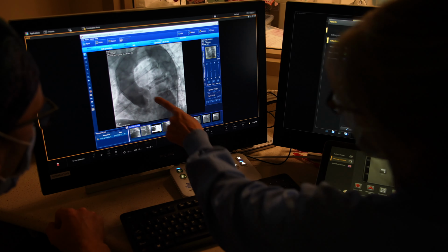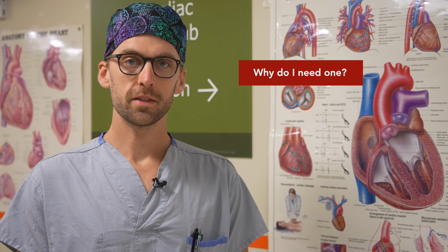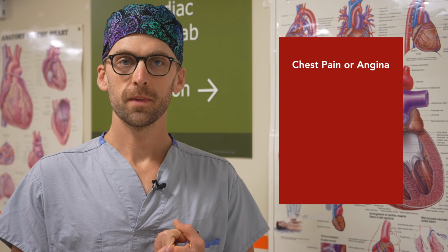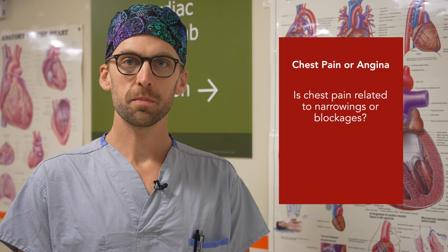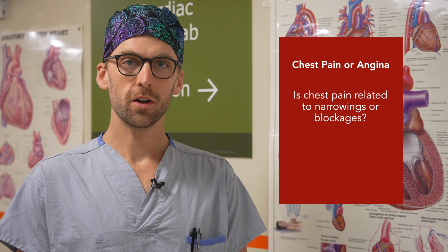During this picture, it is common to feel warm all over, as your heart will circulate the contrast dye throughout your entire body. Patients are sent to have an angiogram for many different reasons. These may include chest pain or angina. Your doctor may have ordered an angiogram to determine if the chest pain you're experiencing is related to narrowings or blockages in the heart arteries.